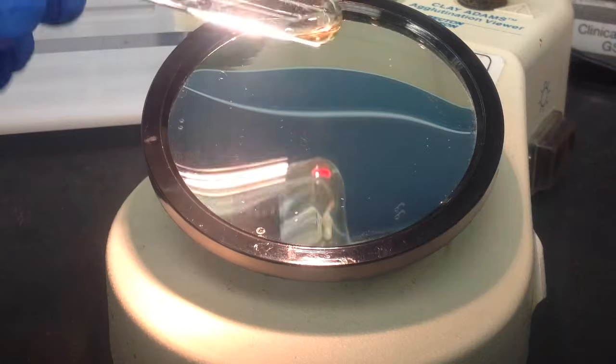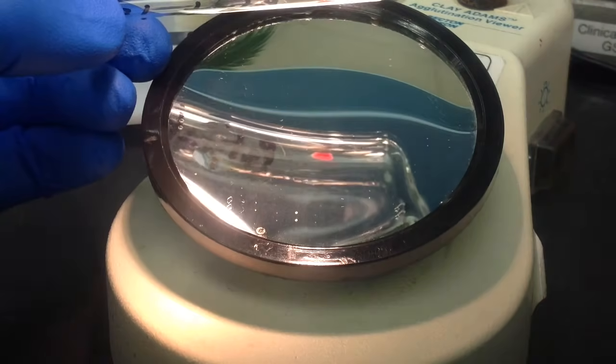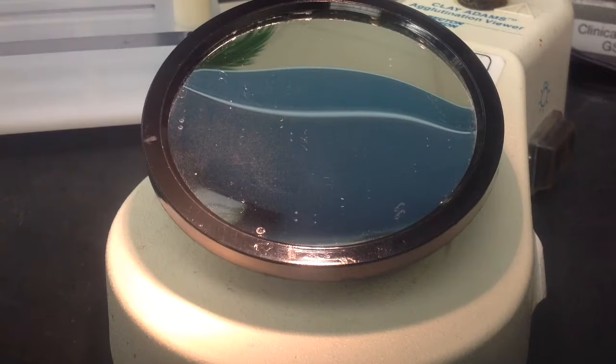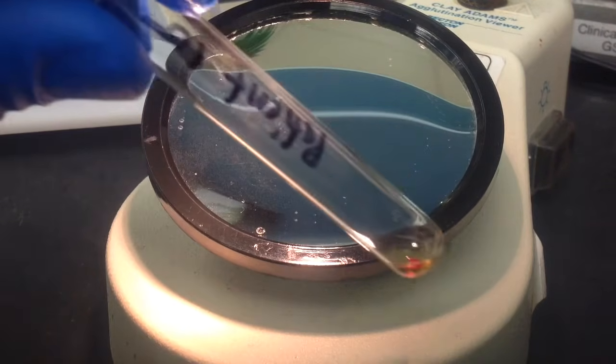And then with the reverse, both the A1 and the B reagent red cells are both 4-positives. And you can see that single cell button.